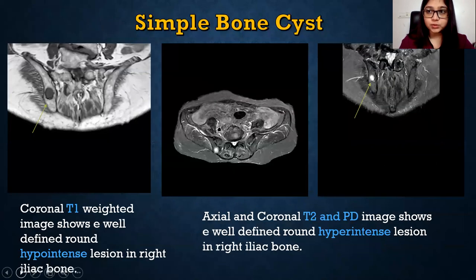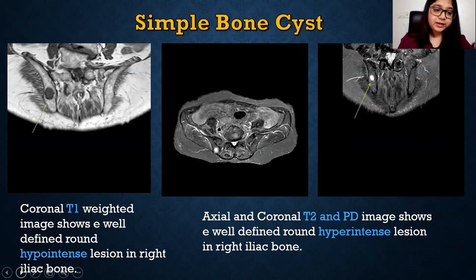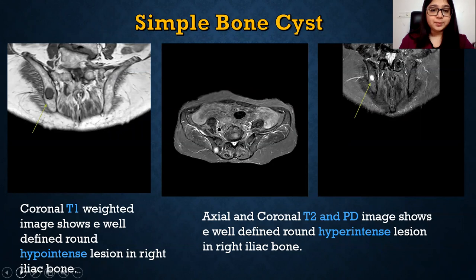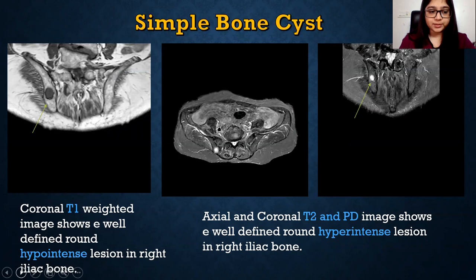Simple bone cyst: coronal T1-weighted image showed a well-defined hypointense lesion in the right iliac bone. It was hypointense on T1 and hyperintense on T2. It was an incidental finding of a simple bone cyst, and the patient had no complaints.